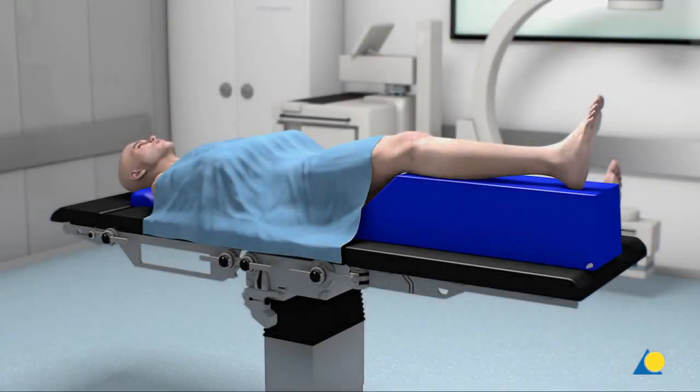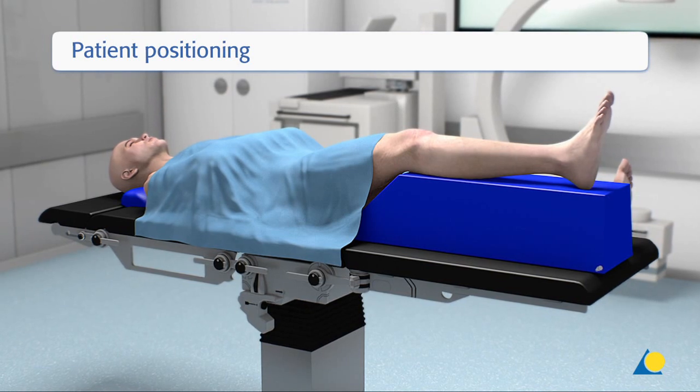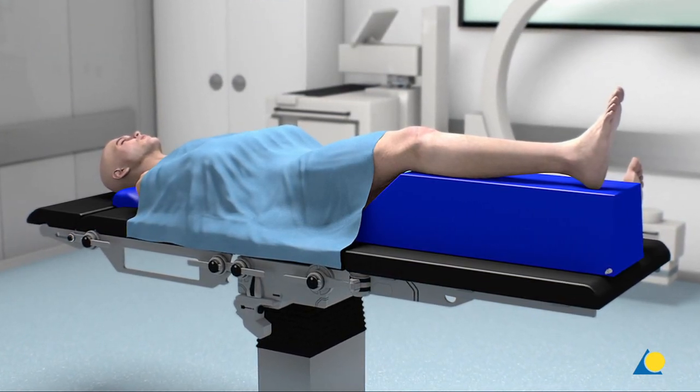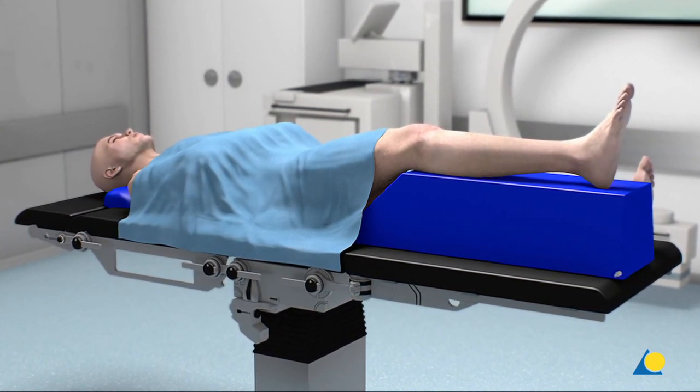The patient is positioned supine. The surgeon is seated near the foot of the table and might move from medial to lateral, depending on whether working from dorso-medial, from dorso-lateral or from distal.